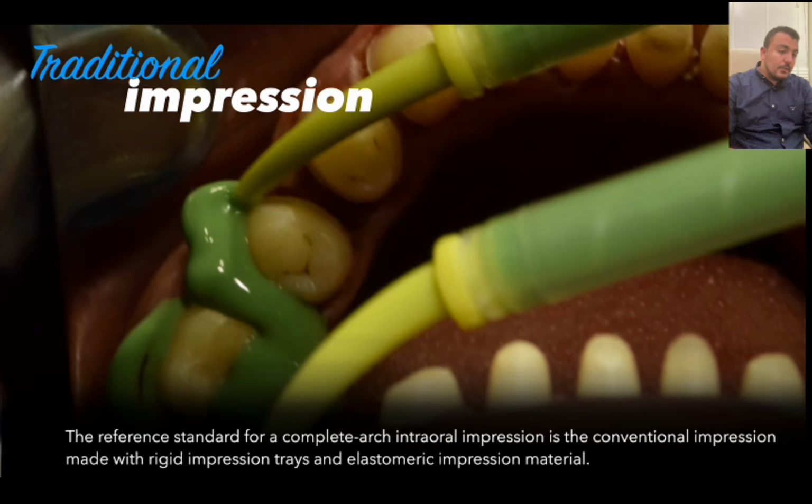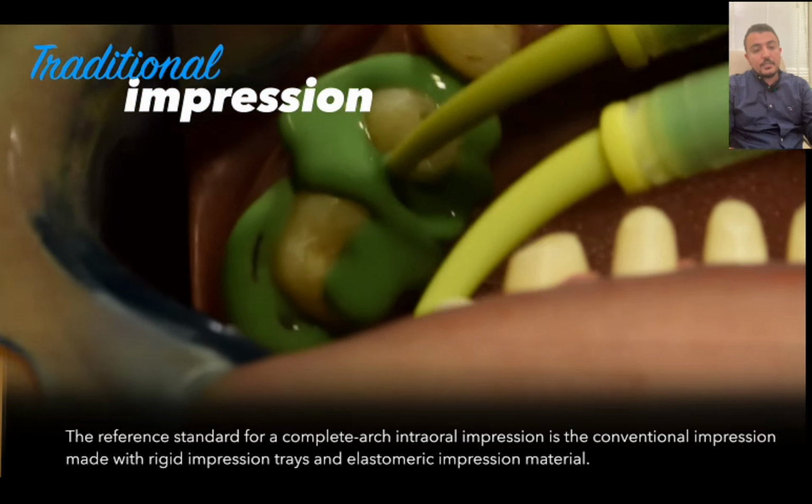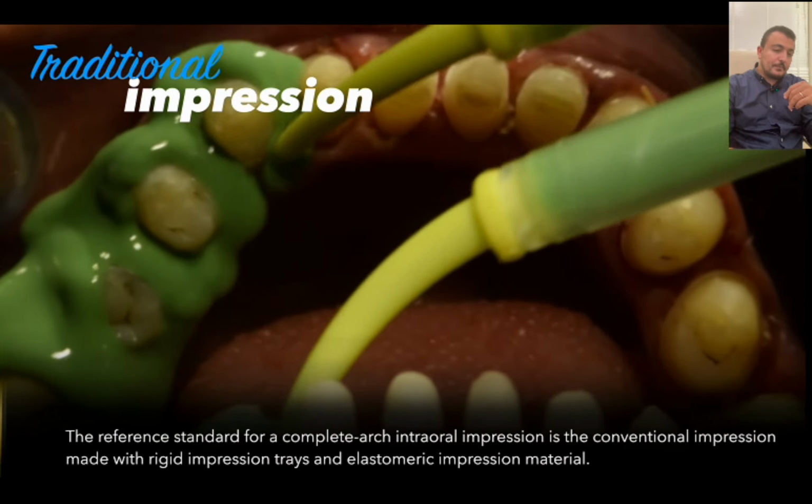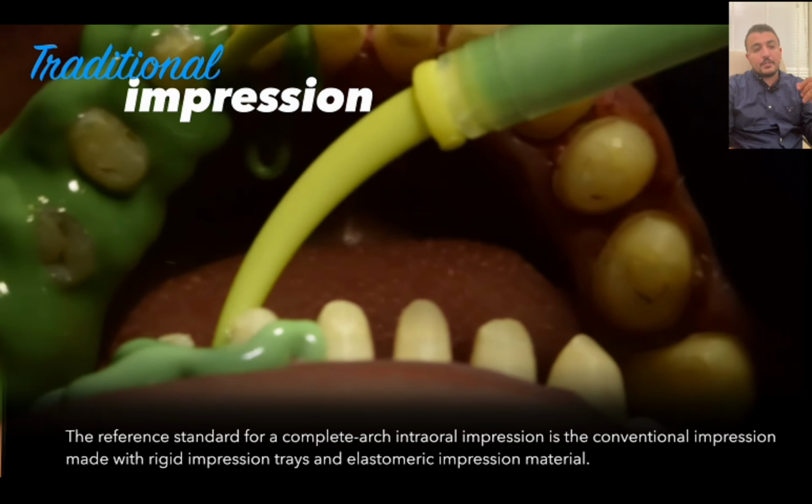And we all know, as I discussed before, that the traditional impression was the reference standard for complete mouth rehabilitation cases for long decades with elastomeric body wash impressions.